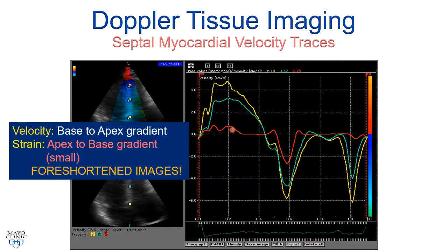Velocity analysis, aside from perhaps measuring the E prime velocity for diastolic function assessment, is not much used in daily practice because of this base-to-apex velocity gradient. Note that when we go on to talk about strain imaging, there is an apex-to-base gradient where strains are highest in the apical segments and lowest in the basal segments. This may be important if you have a foreshortened apical image and you may underestimate these strain values.